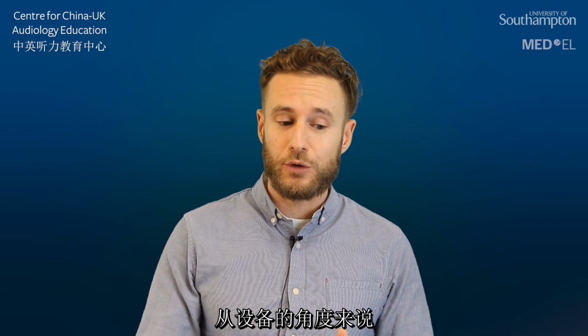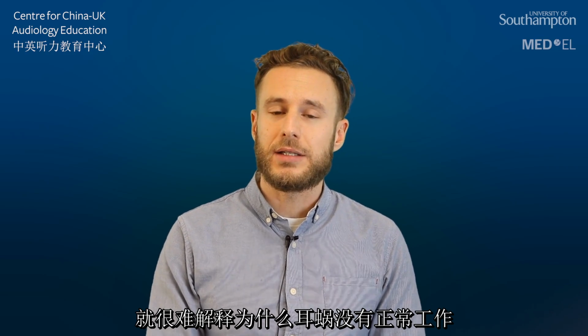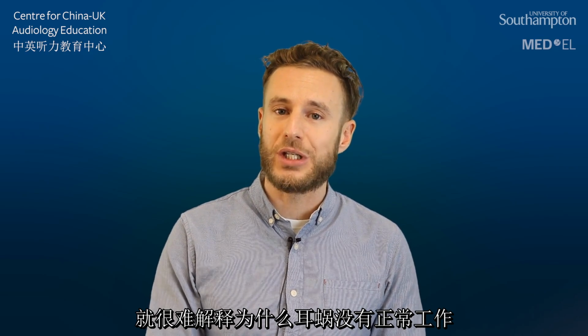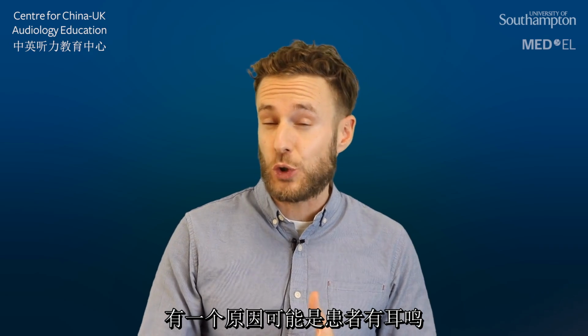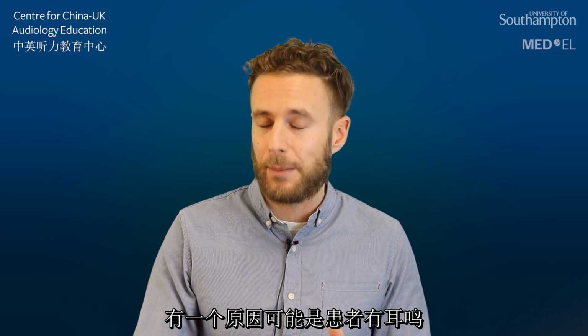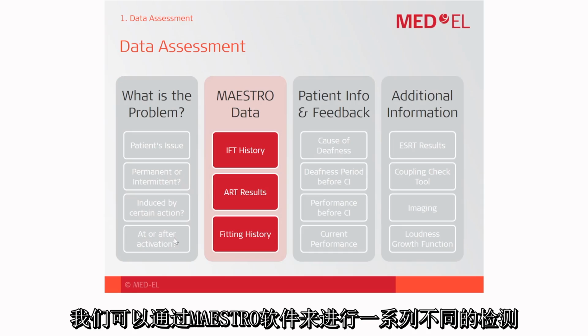From a technical point of view, it's difficult to find an explanation when the CI user is reporting a problem while the processor is not used. So this could be related, for example, to tinnitus. Our Maestro system software allows us to carry out different objective measurements.